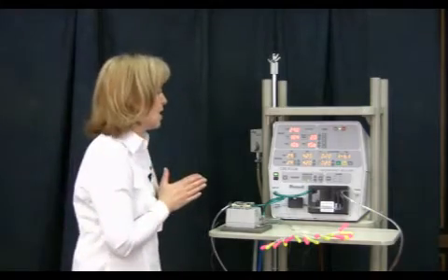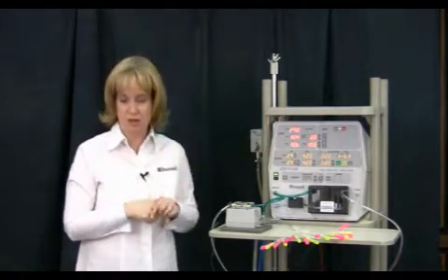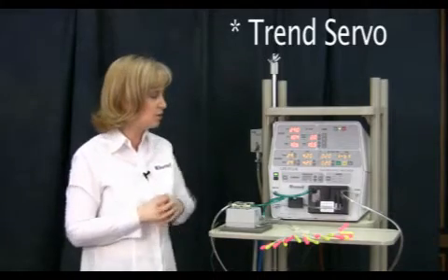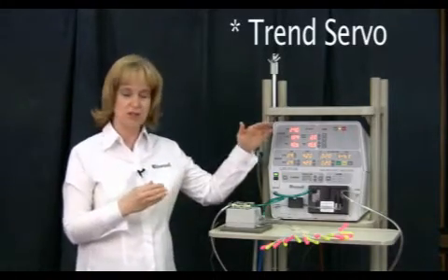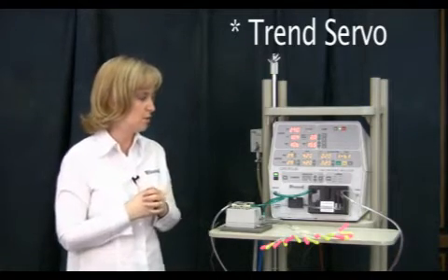All right, so that pretty much sums up servo pressure. Always keep in mind that you do want to document your servo pressure and trend it. When you get your patient set up, you find your baseline and then you trend from there. And you're definitely going to monitor that number.